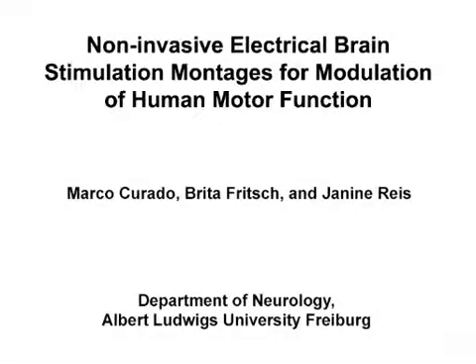The overall goal of this procedure is to demonstrate the localization of the primary motor cortex and correct placement of electrical brain stimulation electrodes to modulate the motor system.